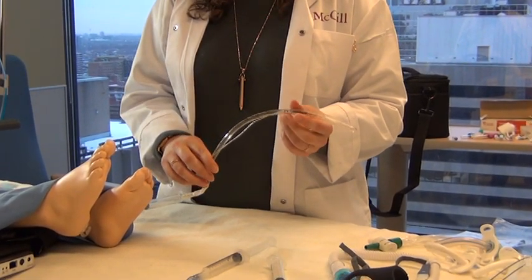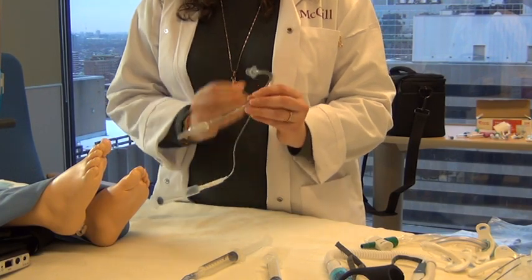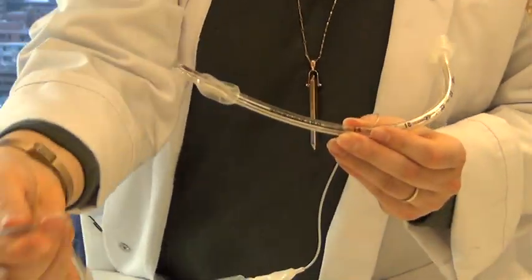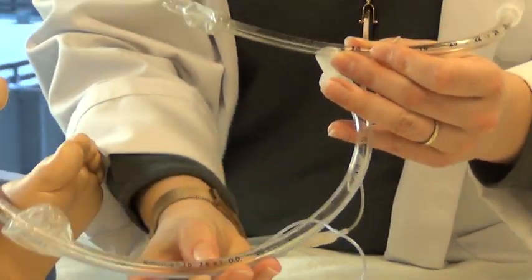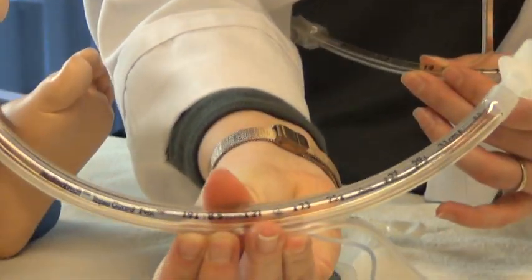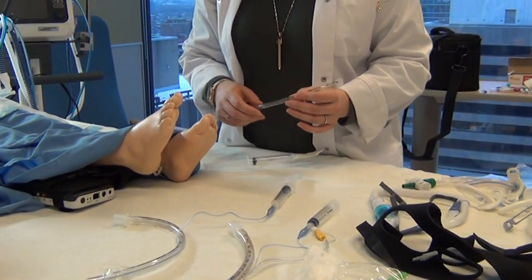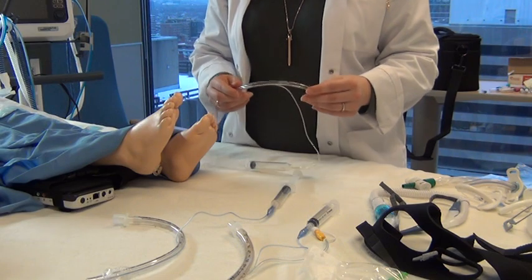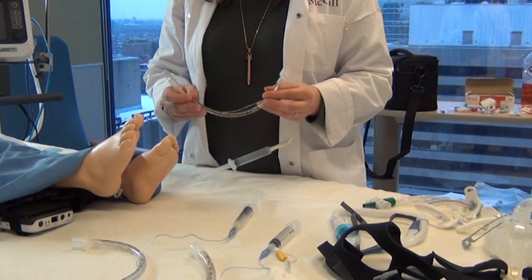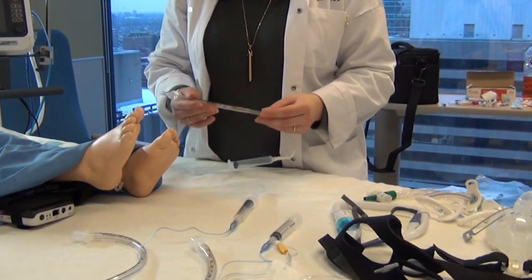So endotracheal tubes come in different sizes. They could be small, like this one, for example, is a 6.0 tube, whereas you might have a size 7 tube, or even you might find yourself with an 8.5 tube. So in adults, normally speaking, women will have a 7.5 to 8, and men will have an 8 to an 8.5 tube. Whereas the 6 will be either for very small adults or even just older children. And in pediatrics and neonatal, you have even much smaller tubes, actually.